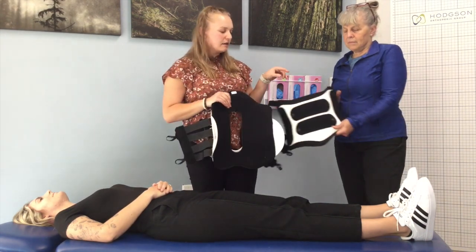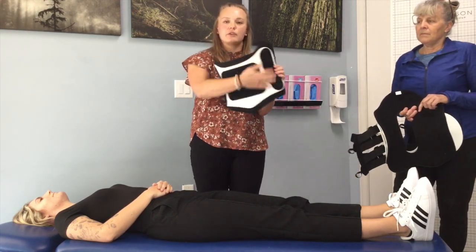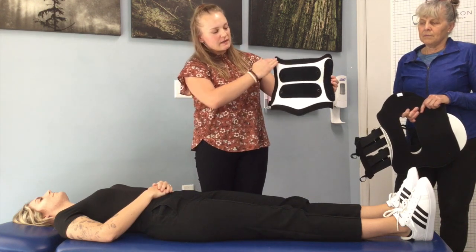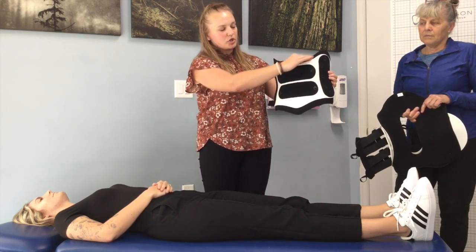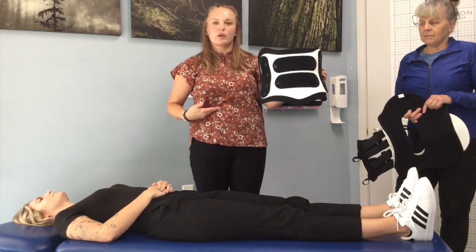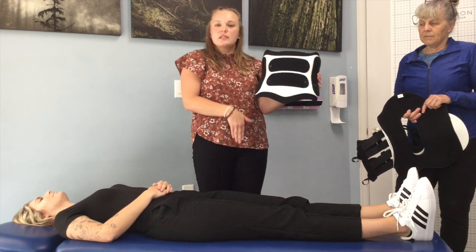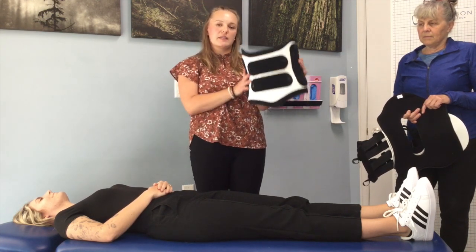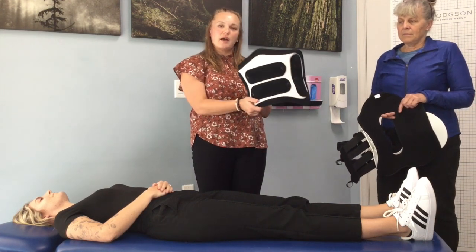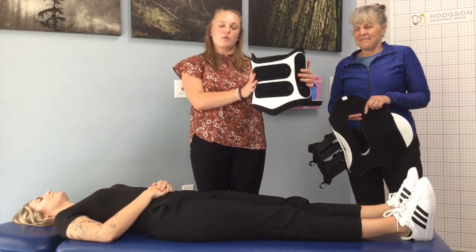On the anterior portion, we have some padding and Velcro-sensitive material. Notable on this is the swoop in the top portion, or what we call the proximal end. This is what's going to rest on the lower ribcage, and then this pointed piece is going to extend into the pubic symphysis area to lock onto the pelvis and ensure the brace is secure. Sometimes these pieces can be upside down or backwards, so we want to ensure this is the right way up.